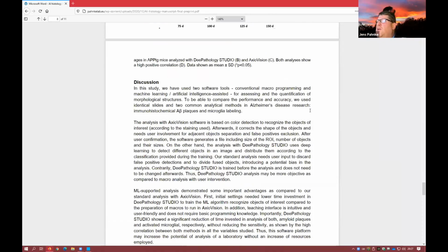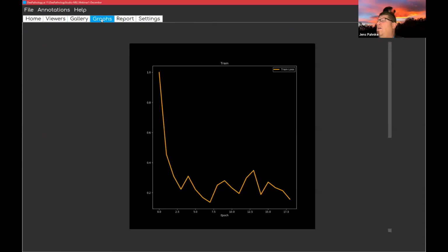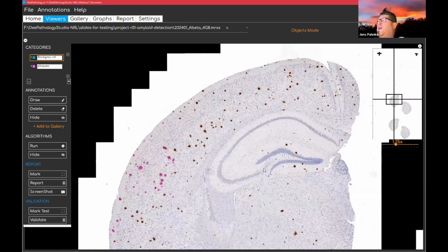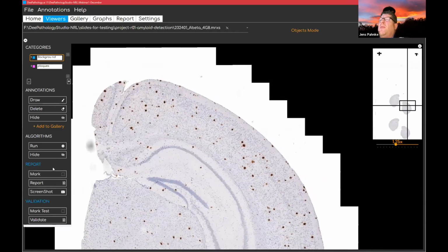So you can download this, you can read this, also the discussion and some information about the background of what we did. So let's go back, and we are having a look at the graph. So we are at epoch 18 approximately now, and you see it goes down. We have 3 times or 4 times added new examples, and it's learning like this. So now we can go into our viewer and select another location of interest for us.